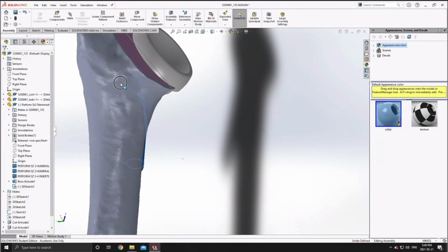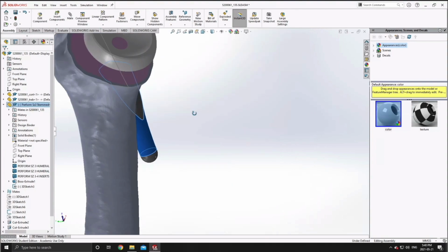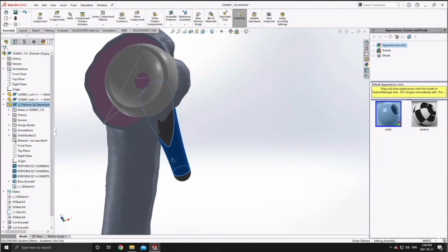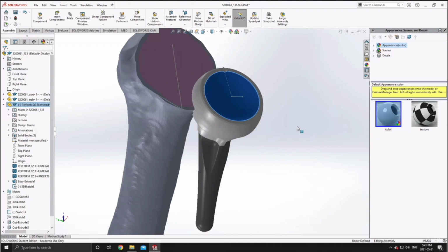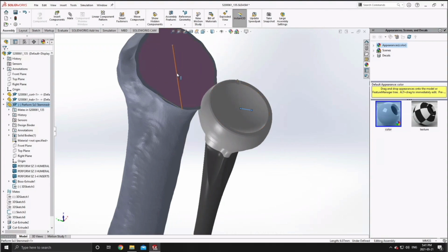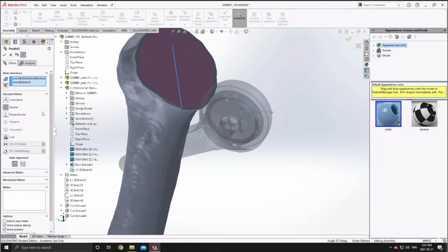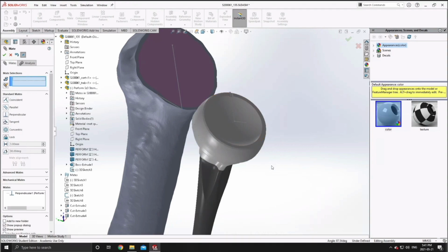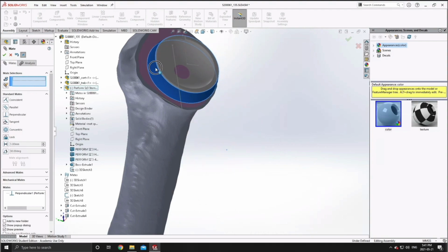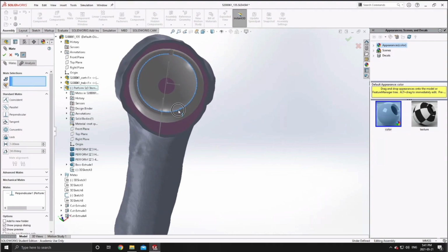So most of the implant positioning should be relatively straightforward, but it's probably good just to note that it's absolutely essential that on the implant file itself you develop some kind of relevant coordinate system. So you can see there I've created a couple sketches directly in the implant part file which allow me to choose orientation relative to those original cut planes and positioning planes that we developed earlier, as they're all relevant to the bony anatomy of the 3D bone models that we've developed.